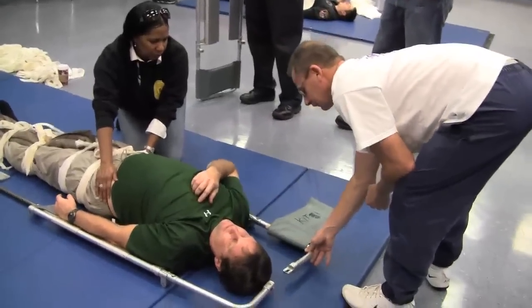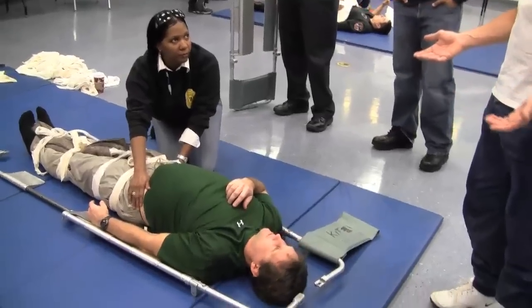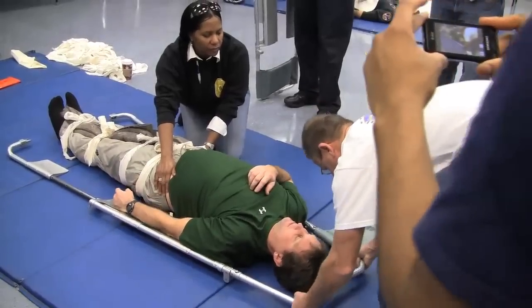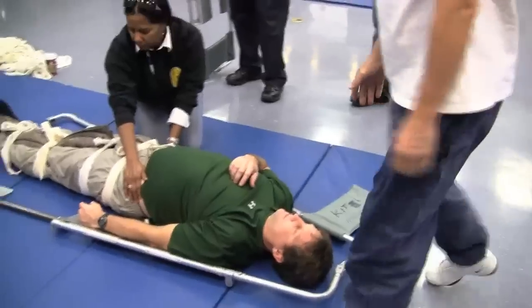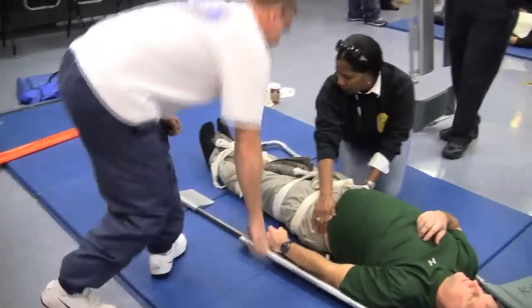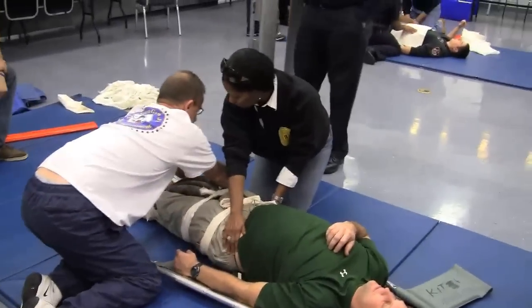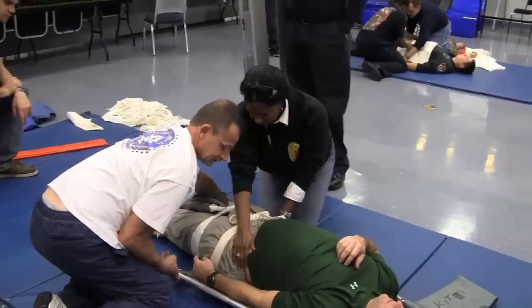All right, so now we've got a problem. It's called a scoop stretcher for a reason — you're scooping somebody. So you're going to come up here and click that head. Then come back here; the partner still has him. I'm going to reach over her and basically pull this in as far as I can.